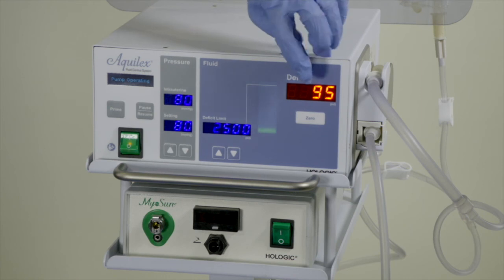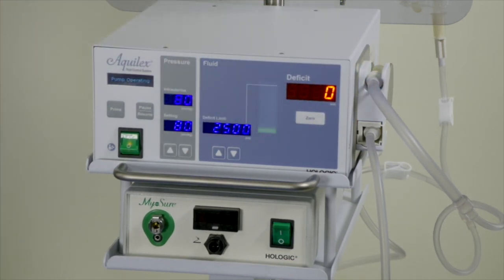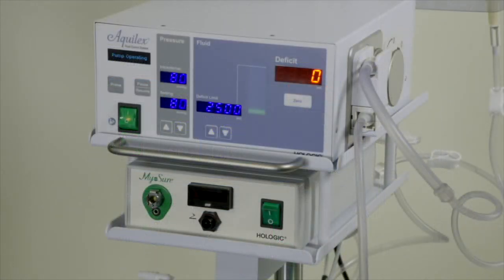Press and hold the zero deficit button on the Aquilex pump. This will zero the fluid deficit used during the priming. You will hear an audible sound and the numbers on the screen will reset to zero. You are now set up and ready to begin.